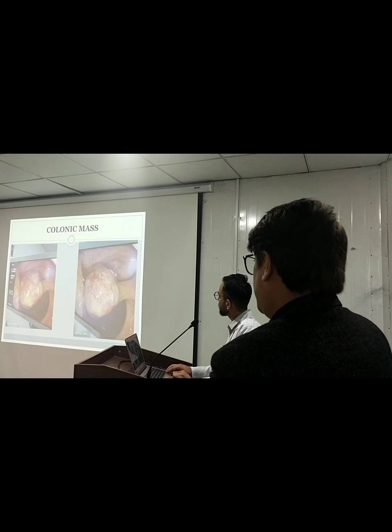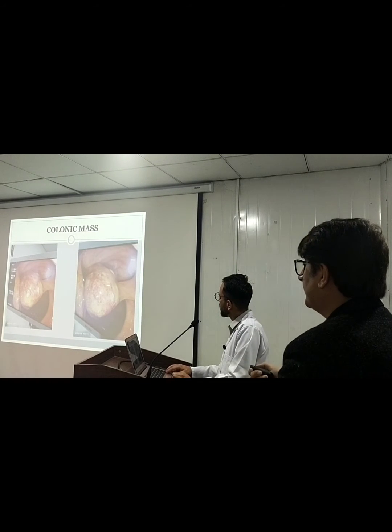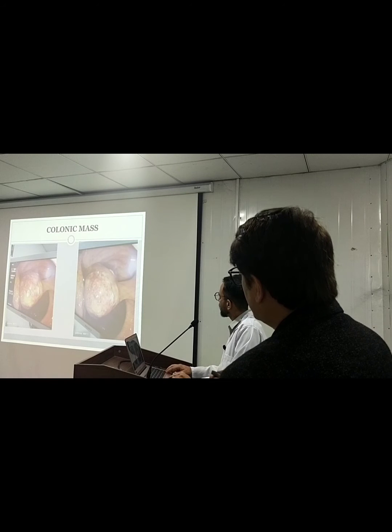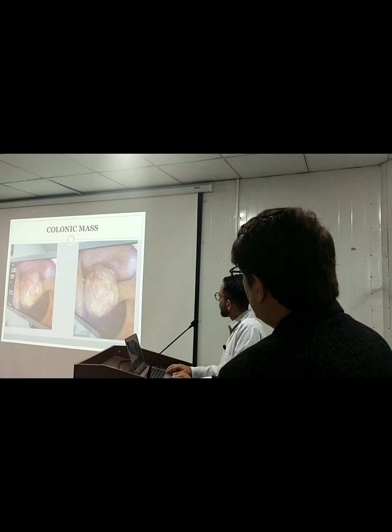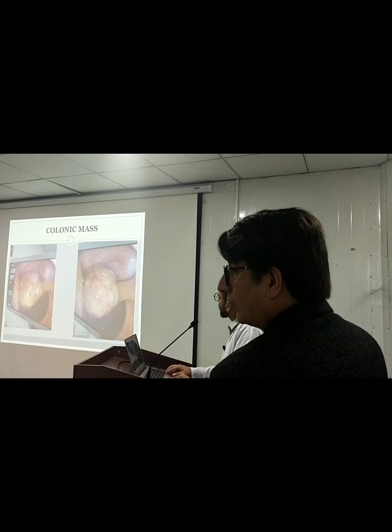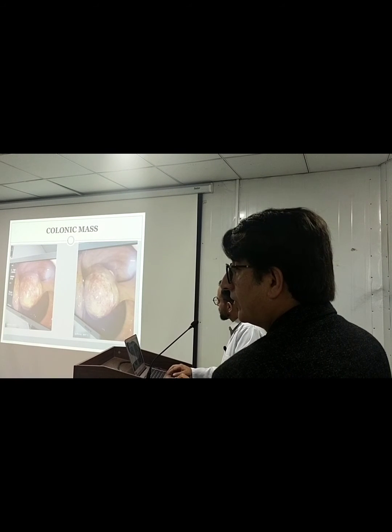Colonic mass. This was a young guy, almost 25 years old, who presented with constipation, lower abdominal pain and bleeding PR. So I did his sigmoidoscopy and colonoscopy, and there was a large polyp with a thick pedicle. I didn't resect this because of fear of bleeding, so I referred the patient to the Don. There they resected it, and unfortunately this turned out to be a malignant polyp. So the patient is under chemotherapy now, and he is doing well. He is a young guy, almost 25 years old.